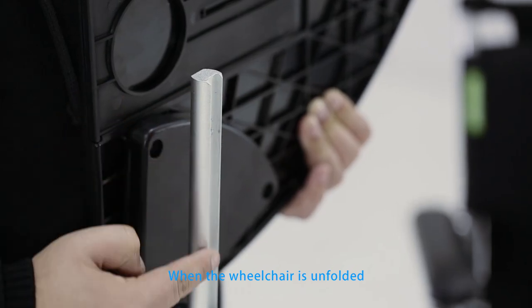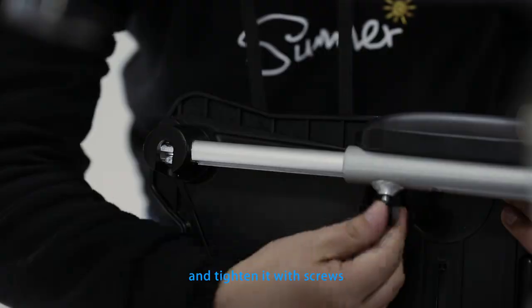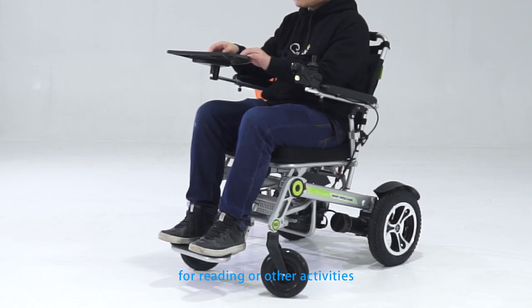When the wheelchair is unfolded, insert the fixing rod on the back side of the wheelchair tray into its right armrest and tighten it with screws, then you are free to flip up or flip down the wheelchair tray for reading or other activities.